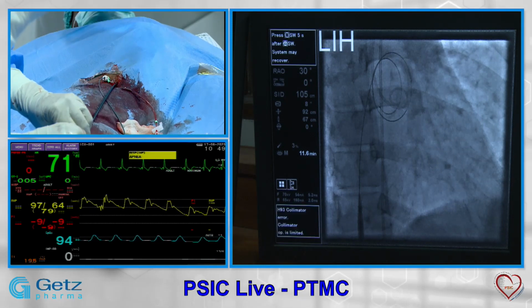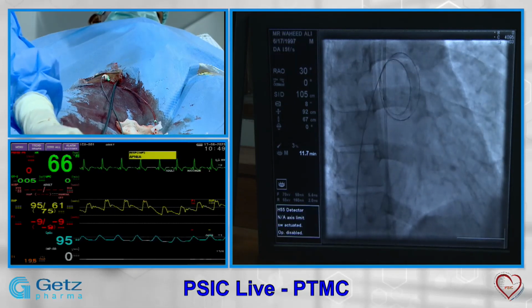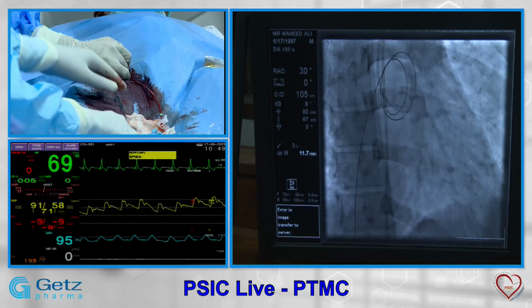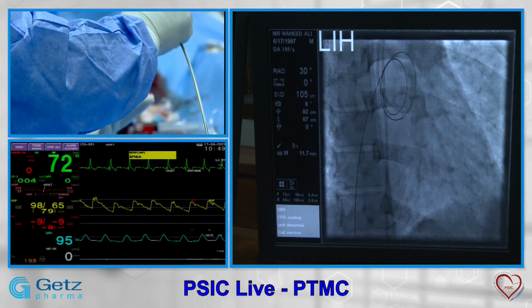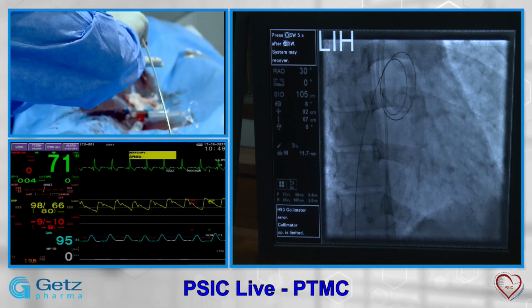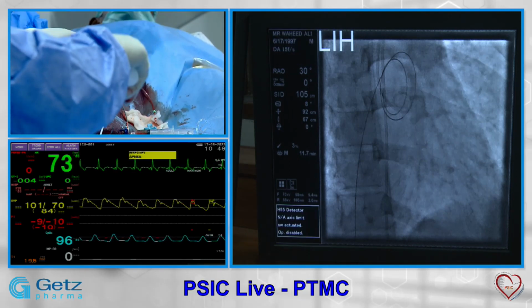The next thing will be you take out this dilator. We have already prepared our balloon. The important thing is that when you take the balloon in, you always measure it with the caliber, so that your target balloon is right. We all know that this patient has a height of 160 centimeters, so that makes him eligible for a 26 balloon.